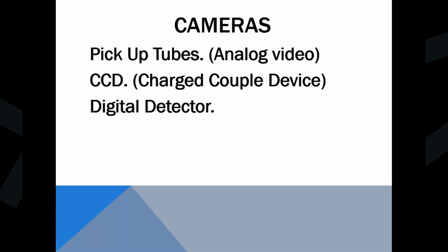And some unscrupulous mammography companies will call their digital detectors, and they're actually a CCD camera. So they'll advertise that you're getting a digital image, and it's kind of up for debate whether you can really call a CCD image a digital image. They are solid state, so there is no analog to them, but they're not totally digital either.